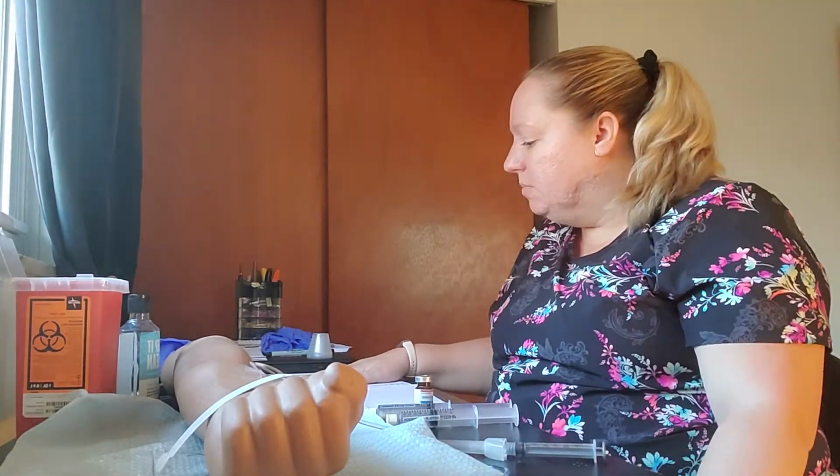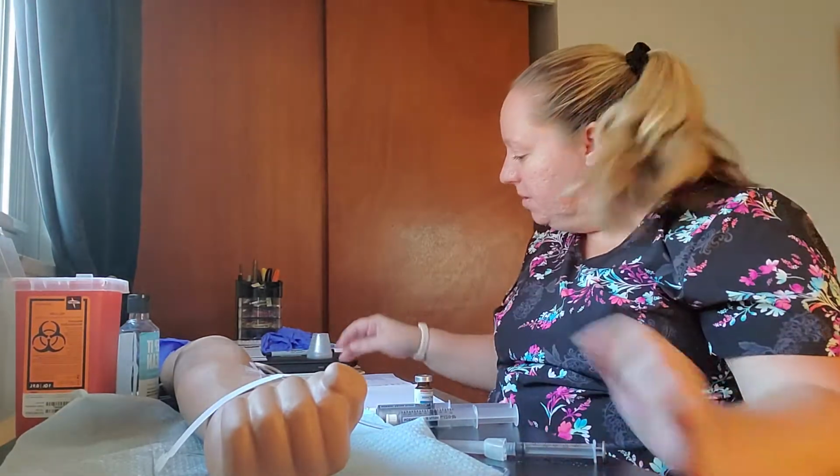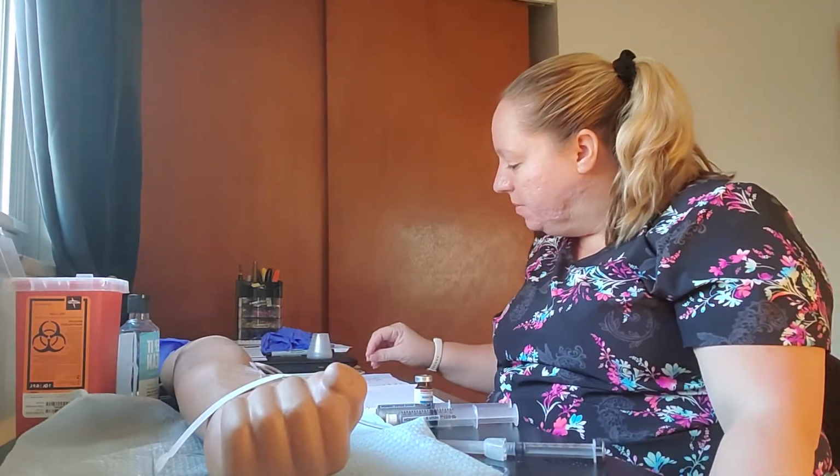So the first thing I'm going to do is just verify her med order. Again, I need two identifiers for my patient, Mary Edwards, 22 of 1940. She does have her ID band on as well. She has an allergy to penicillin. She is getting the bumetanide because she has heart failure and she's having some shortness of breath.